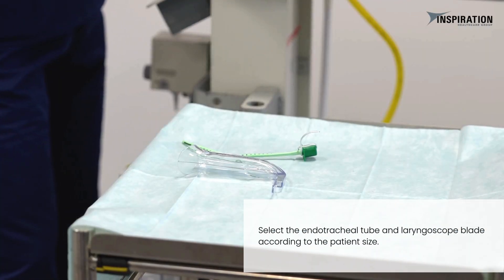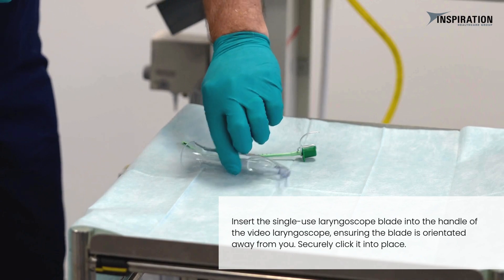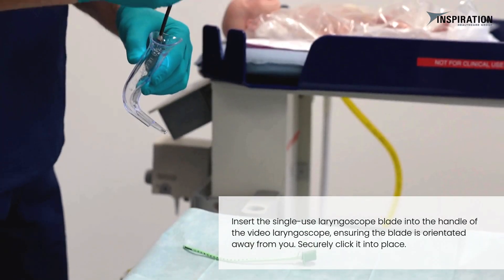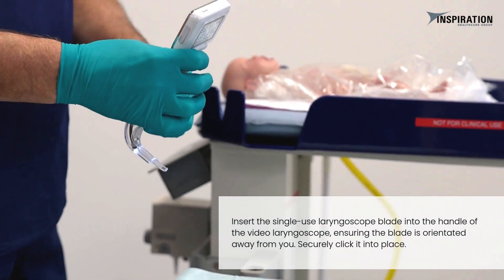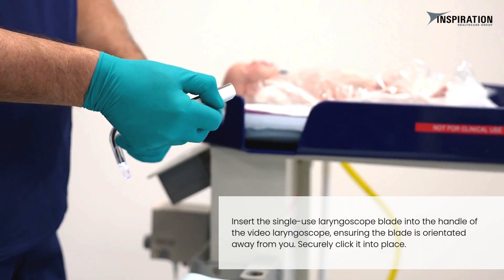Select the endotracheal tube and laryngoscope blade according to the patient's size. Insert the single-use laryngoscope blade into the handle of the video laryngoscope, ensuring the blade is oriented away from you. Securely click it into place.